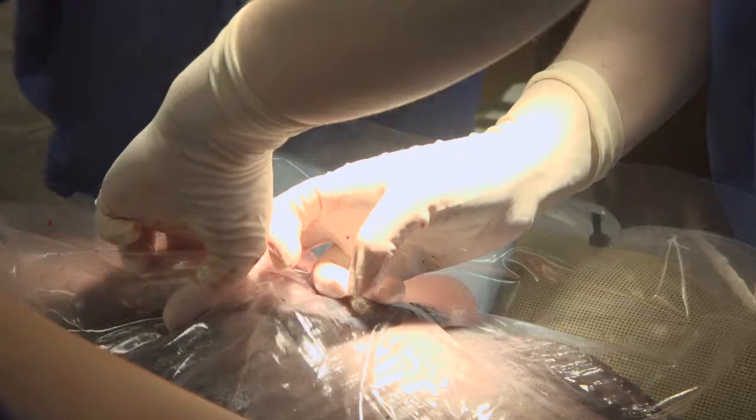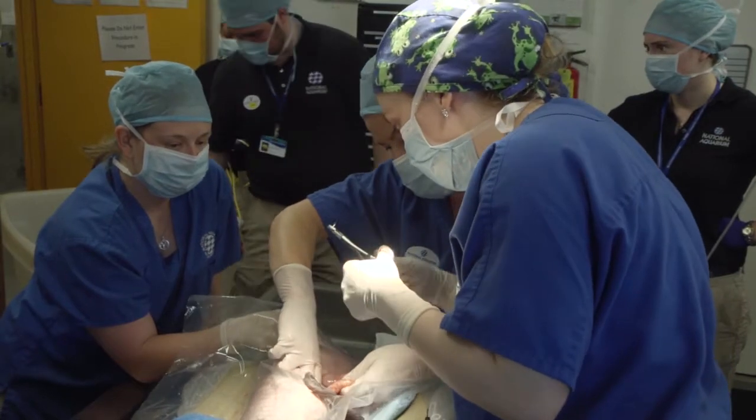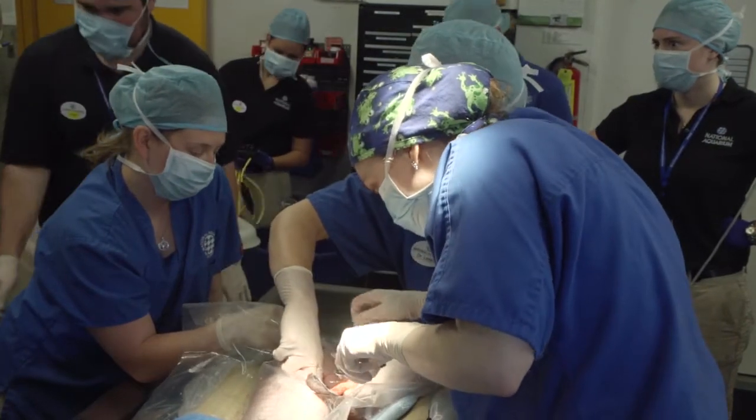We'll look around at all of the different organs and see what looks normal and what doesn't look normal. With Mrs. Bojangles, we weren't sure what we would find — if it would be something really difficult to fix or something pretty easy — so we were relieved when we opened her up and it was something that we could easily fix.